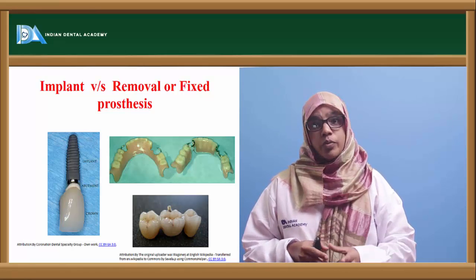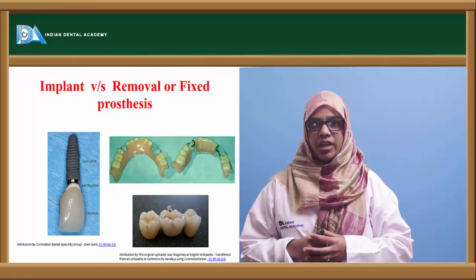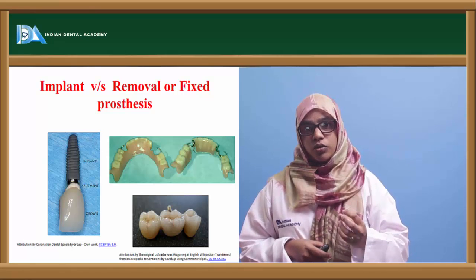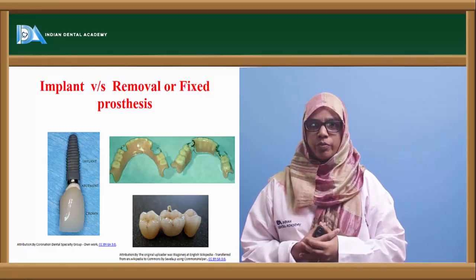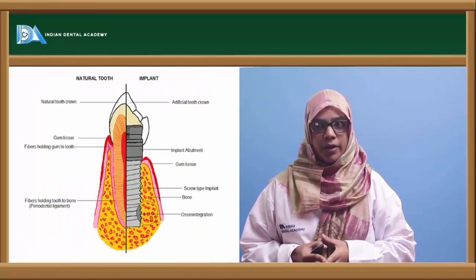But fixed prosthesis also takes support from the adjacent tooth to bridge that area. Eventually, caries can take place because of marginal leakage of the cement. The tooth on which we have put the bridge undergoes caries, and you eventually have to extract that tooth and increase the span of the fixed prosthesis. Now this was overcome with the introduction of the implant.